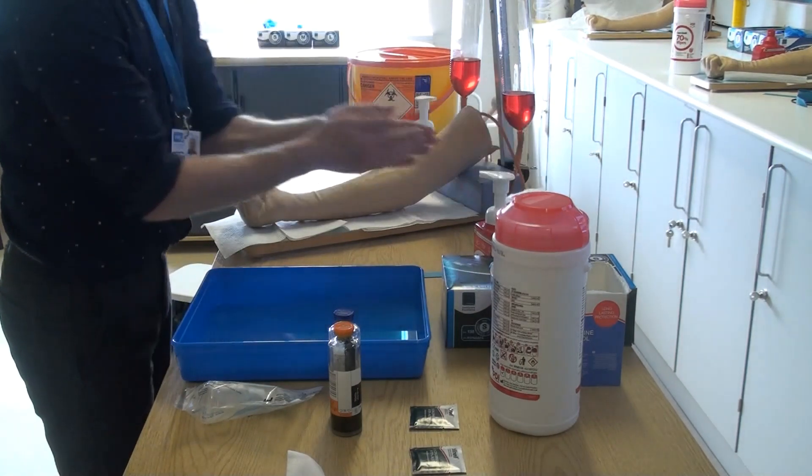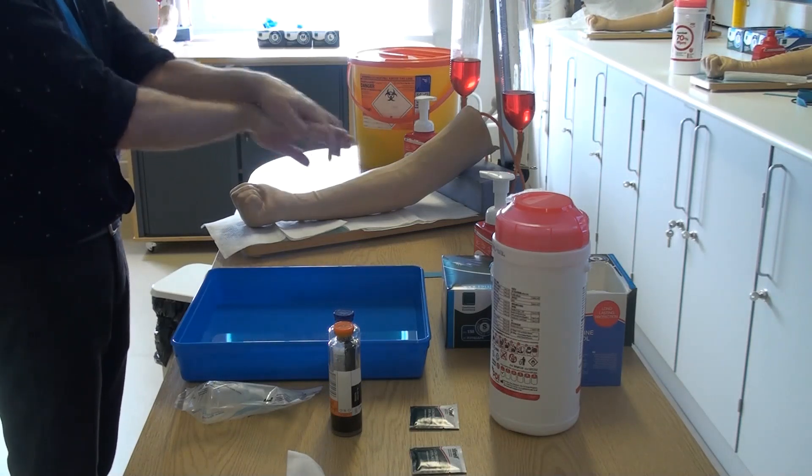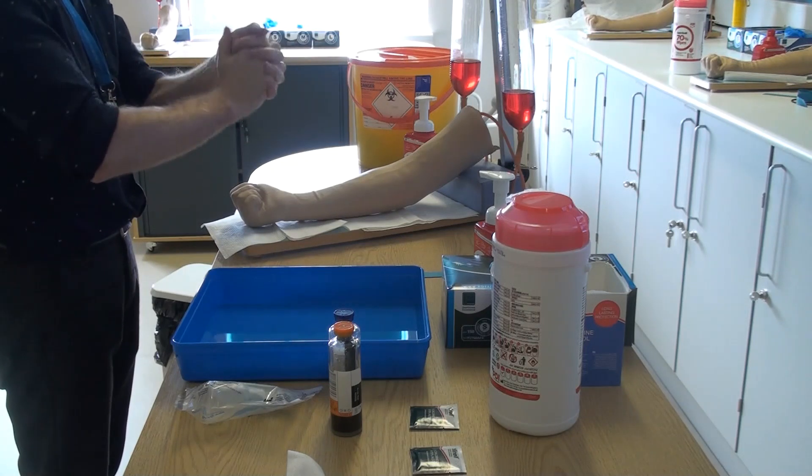When taking blood cultures, start the procedure by doing a seven-step technique of hand hygiene as set out by the World Health Organization. You may use soap and water or alcohol gel on visibly clean hands.